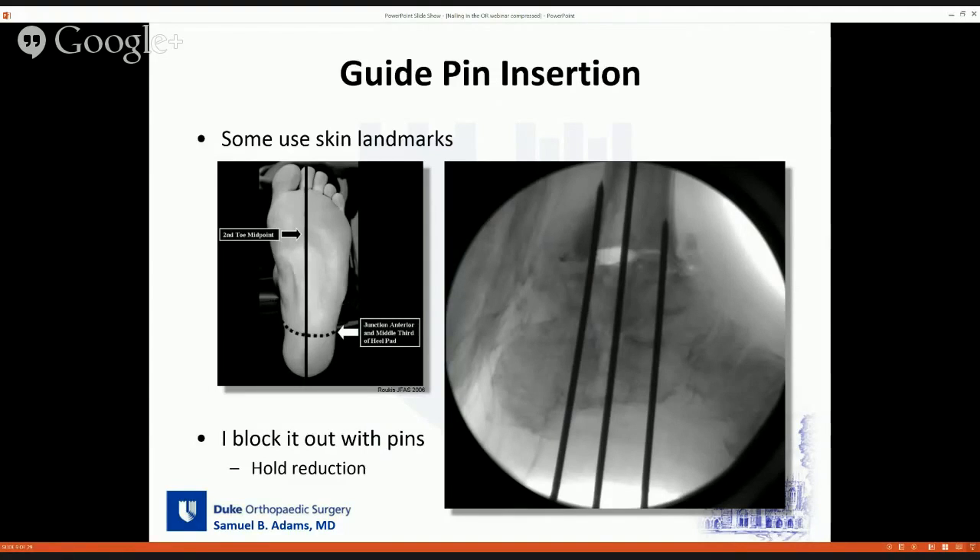The most important part of this case is the guide pin insertion. Several different landmarks have been described. Looking at the plantar aspect of the foot, you can draw a line from the second metatarsal/second toe straight back posteriorly, then try to estimate the junction of the anterior and middle third of the heel pad. This is somewhat difficult, especially in an obese patient. I usually pin the ankle joint anyway — I put what I call peripheral pins to block out the anterior and posterior, which holds the ankle in the exact position I want. Then I go between those pins, which usually gives me a good starting point under fluoroscopy.